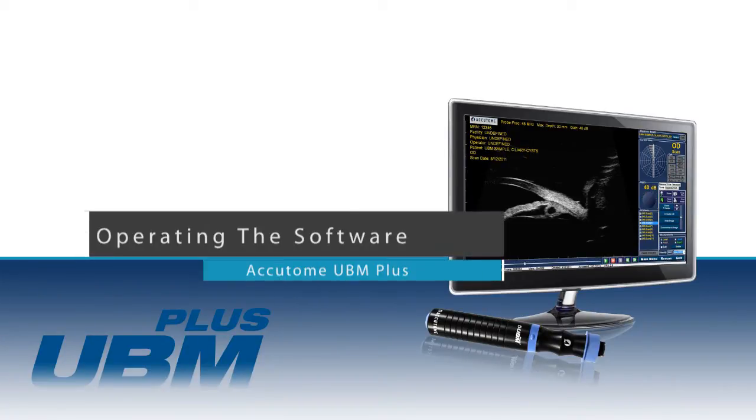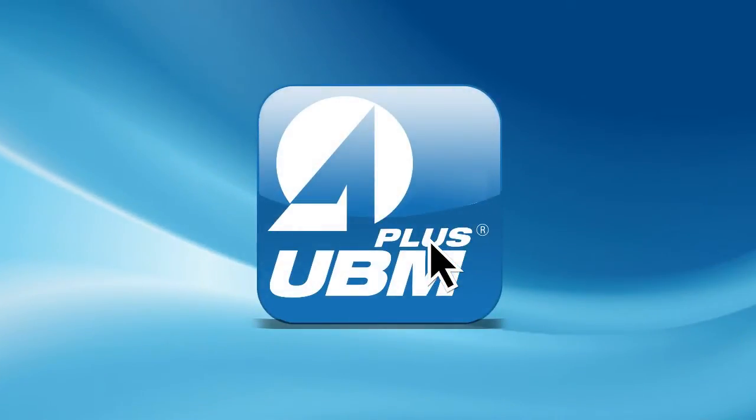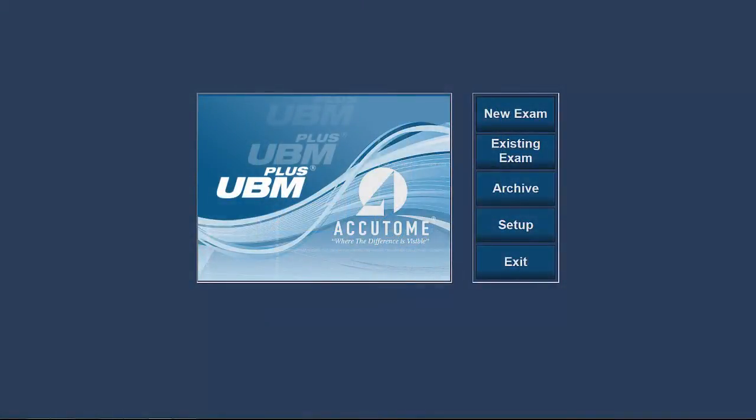Operating the software: once installed, the Accutome logo will appear on your desktop. In order to start the software, simply click on the Accutome icon. The software will open to the main screen and provide five options: New Exam, Existing Exam, Setup, Archive, and Exit.